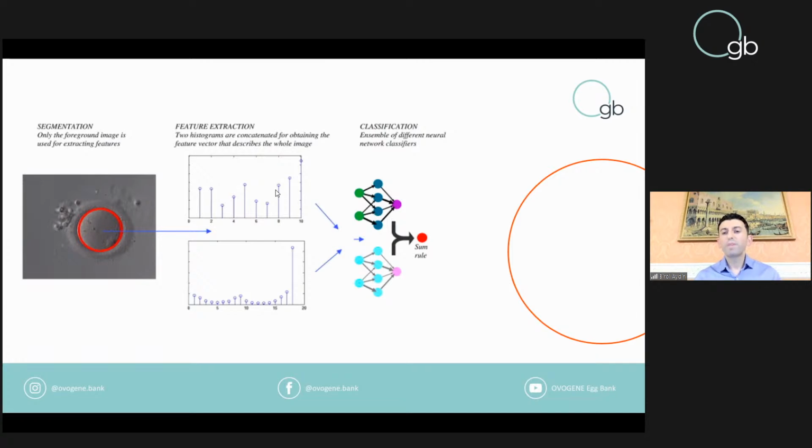It will start to make a mathematical calculation, as there are a lot of different measurements. All these measurements will be kept on one side, and from the other side, all the efficiency reports will come. When I explain all of this, you may think, how long should that take? Maybe you think in 5 minutes you are keeping your site out. No, it's not like this. All the information for each oocyte, in 10, 15 seconds, is already collected by the main computer and analyzed.